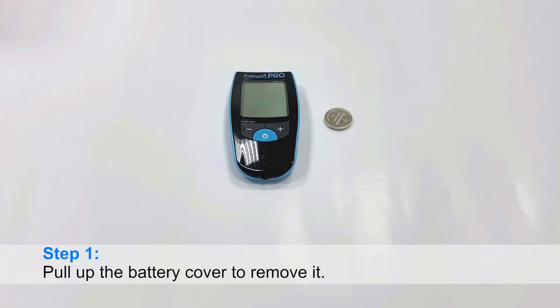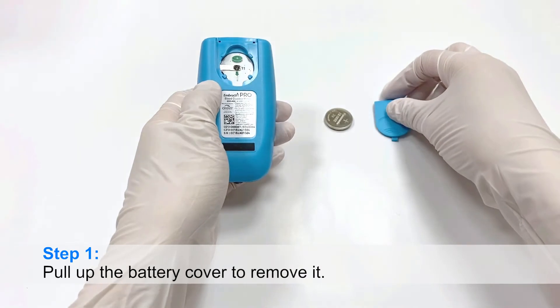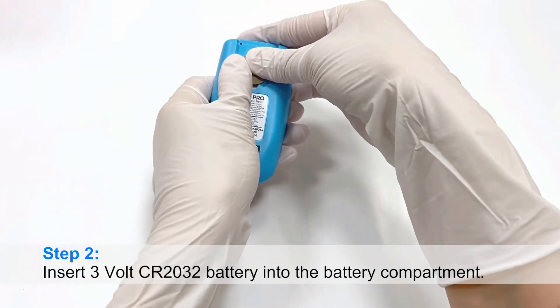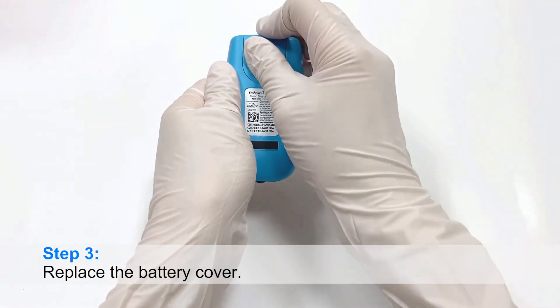Step 1: Pull up the battery cover to remove it. Step 2: Insert CR2032 battery into the battery compartment. Step 3: Replace the battery cover.